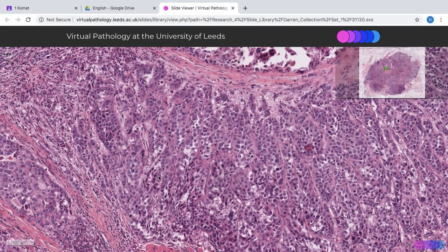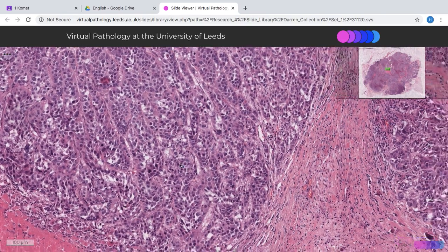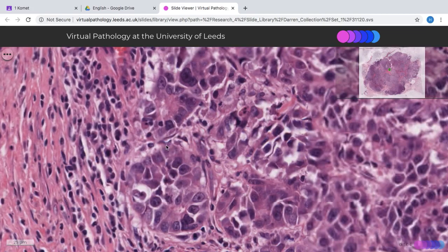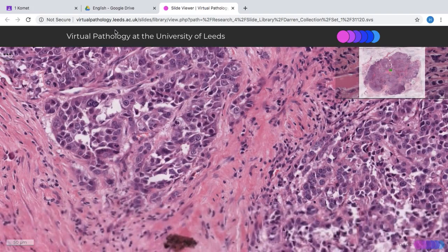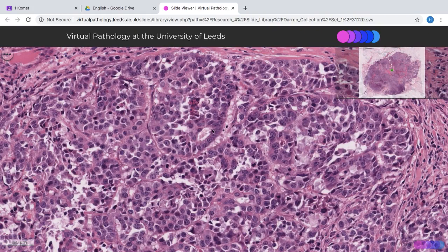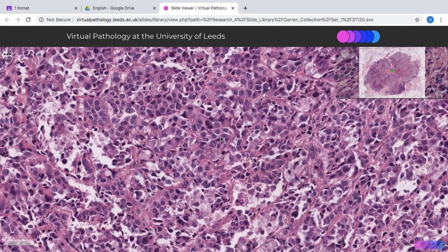It's called the modified Bloom-Richardson grading system. With minimal to non-tubule formation, this will be a score 3. There's probably a hint of tubule formation in a couple of areas, but not a very good one. You can see a lumen formation there, but still very minimal — so a score 3.